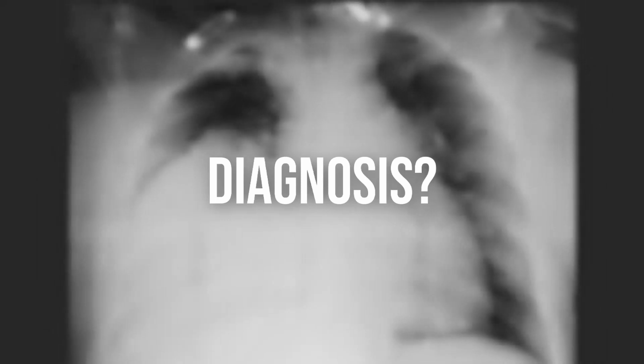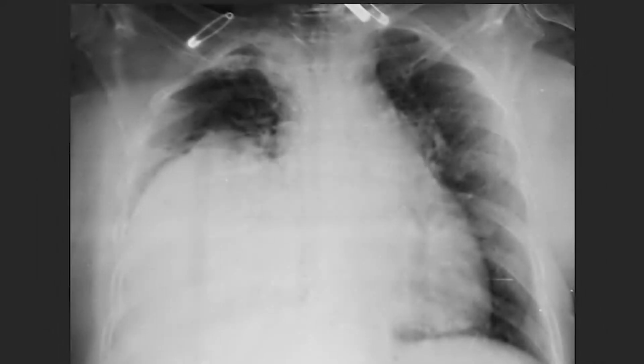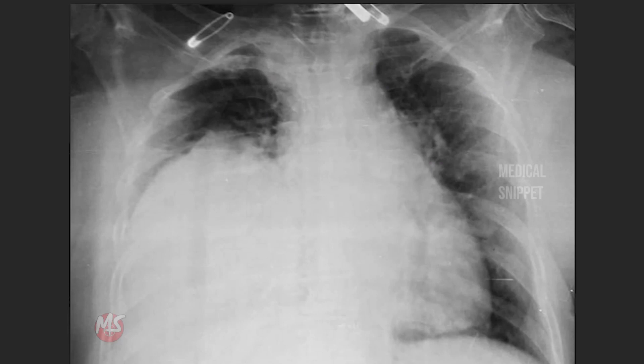Can anyone guess the diagnosis by seeing this X-ray? Just have a look.